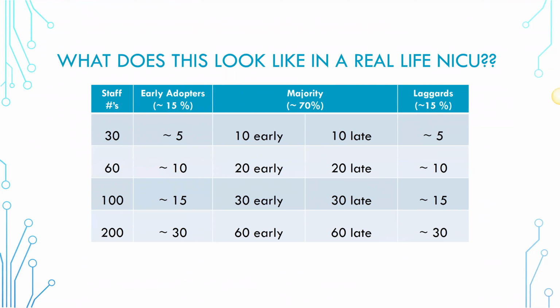In some units where I've been, we've done some QI things where we had neurology participate. They were very interested in the aEEG tool and wanted to make sure people felt confident. So we did some quality teaching for a few months before we started actually documenting in the record. People would go by the bedside and review, and then at a specific time, the neurology team and the neuro-NICU team would do some rounding and look at the aEEG patterns together, and develop some consensus and discussion around why there were differences.